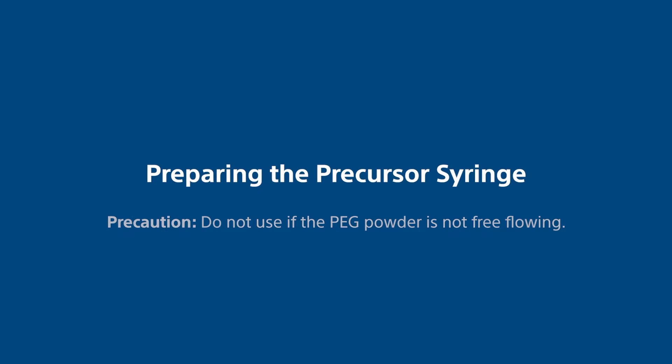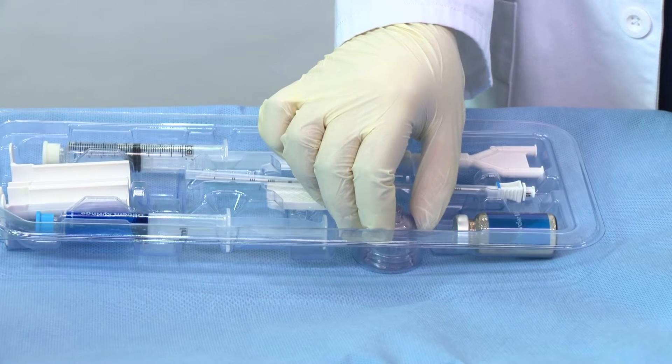Preparing the Precursor Syringe. Precaution: do not use if the PEG powder is not free-flowing.